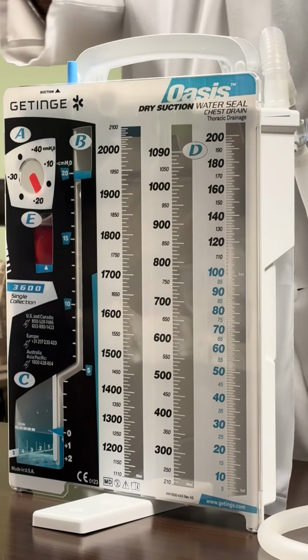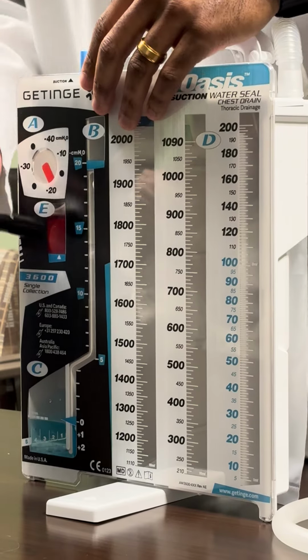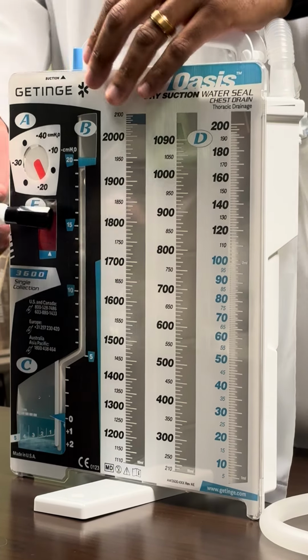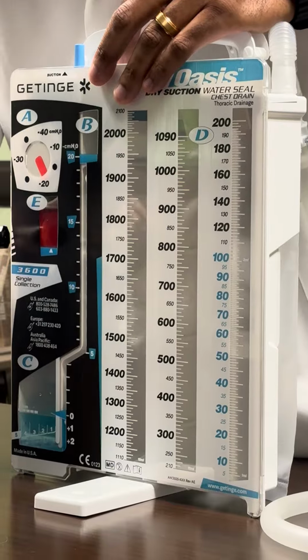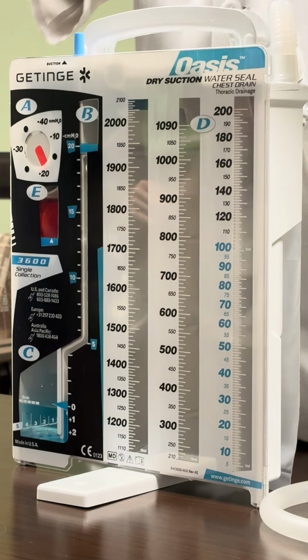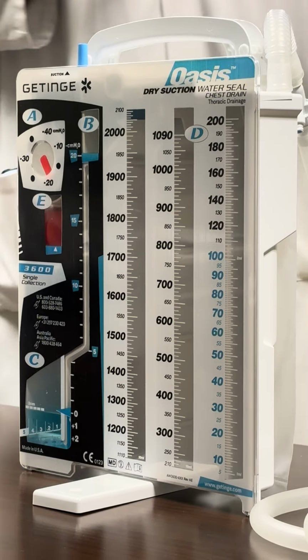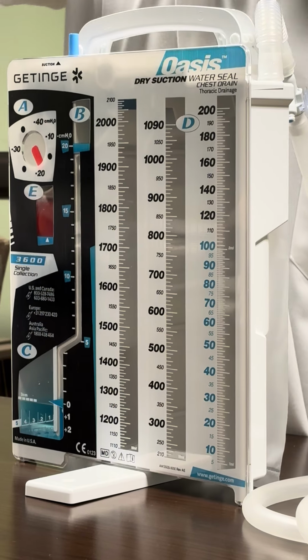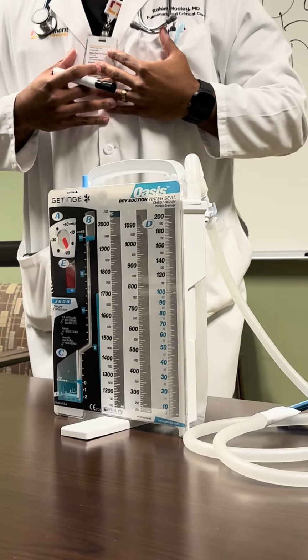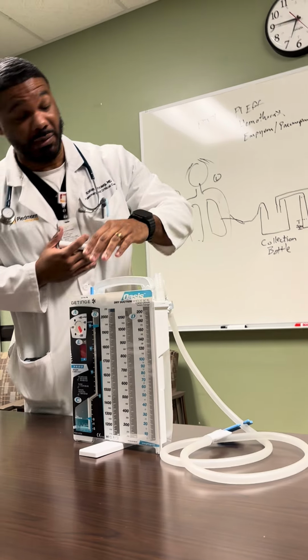So just some things to keep in mind when you're evaluating your chest tubes. You need to look at that bellow and see where it is in relation to that arrow, okay? Because that's part of troubleshooting. Again, you have your collection chamber, and you want to make sure that you are accurately determining how much output you have per your shift, okay? What really helps us out is that we have accurate documentation of what's going on in the chamber.